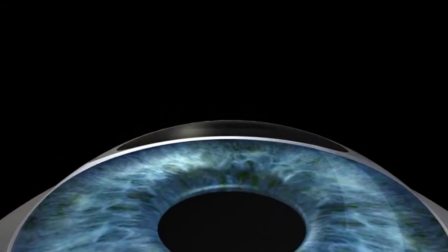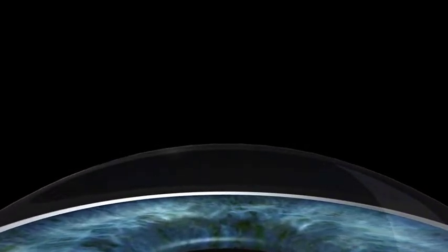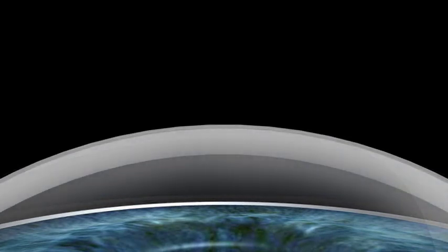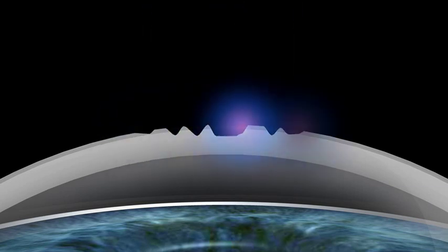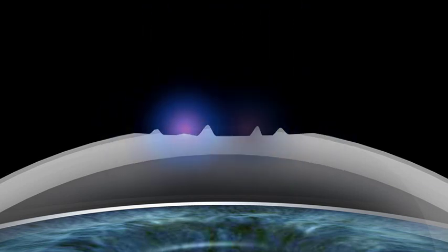TransPRK is an advanced surface laser treatment because the epithelium is removed by the excimer laser more precisely and uniformly than with either manual or alcohol-assisted debridement. TransPRK applies an epithelial thickness profile that is thinner in the center than in the periphery.